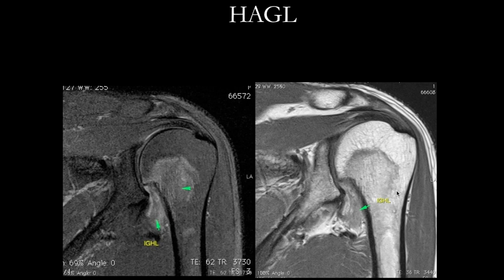Another structure to look at carefully is the inferior glenohumeral ligament in the axillary recess region, which can be injured during dislocation. For the surgeon going in arthroscopically, this is an area which is difficult to visualize, so he wants to know beforehand if it is intact. Here you can see the normal inferior glenohumeral ligament as a well-defined thin hypointense band, but at the humeral attachment it is torn. This is called HAGL — humeral avulsion of glenohumeral ligament. A similar injury at the glenoid side is called GAGL — glenoid avulsion of glenohumeral ligament.